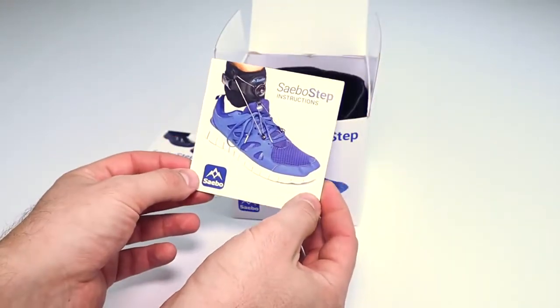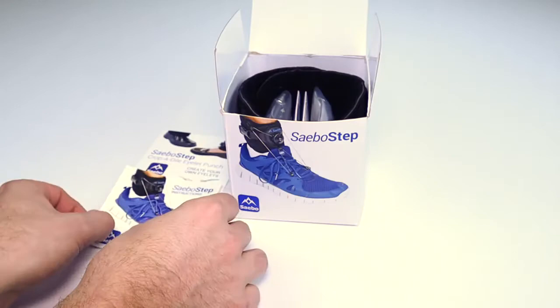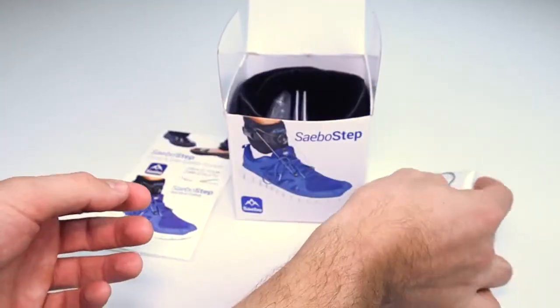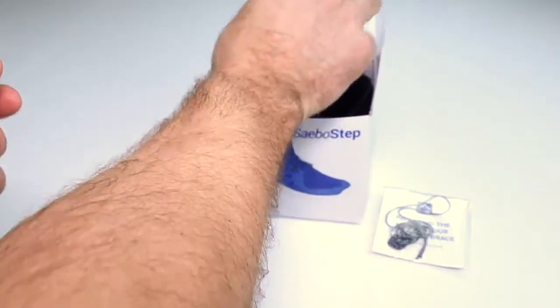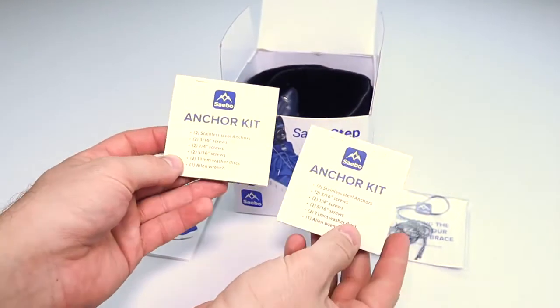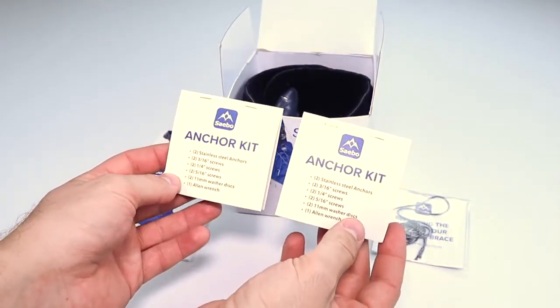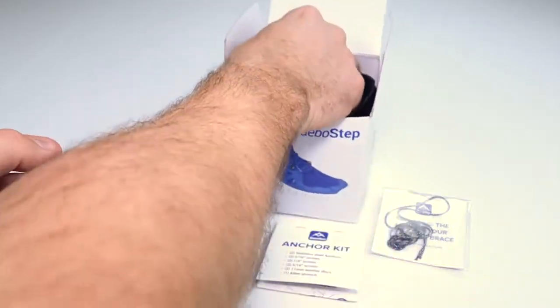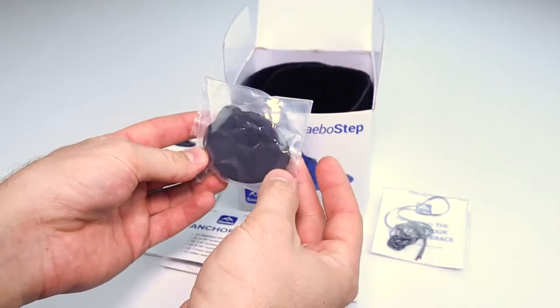Next, you'll find your Sabo Step instructions. Here's a replacement cord, two separate anchor kits — one in black and one in silver to match almost any type of shoe — and padding for extra comfort.